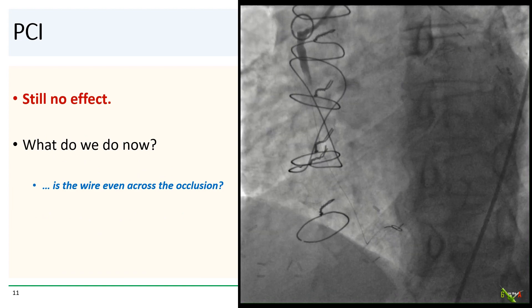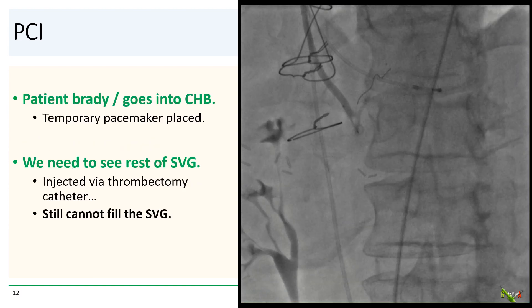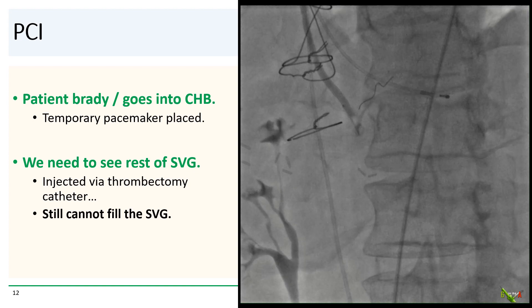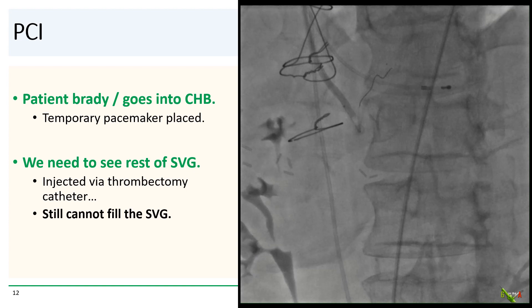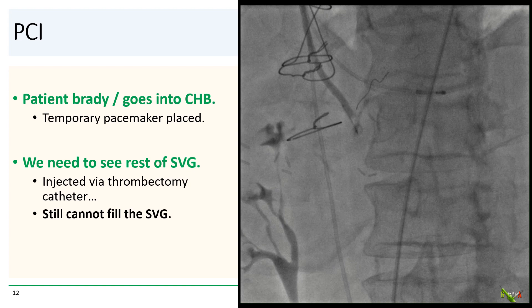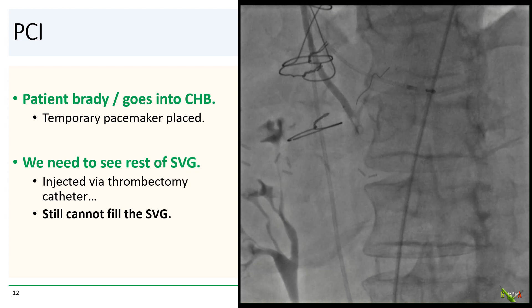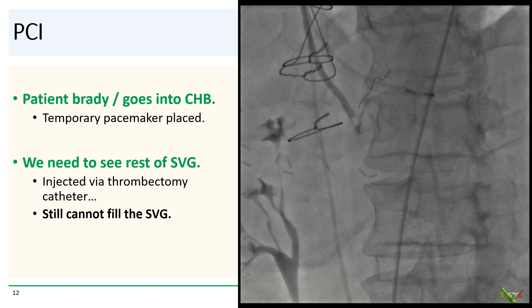We questioned whether our wire was even past the lesion. At this point the patient became bradycardic and went into complete heart block, so we inserted a temporary pacemaker. We really needed to see the rest of the vein graft, so we passed a new thrombectomy catheter as far down as we could and injected contrast via the thrombectomy catheter to opacify the rest of the graft. But even with injection through the thrombectomy catheter, the vein graft would not fill.